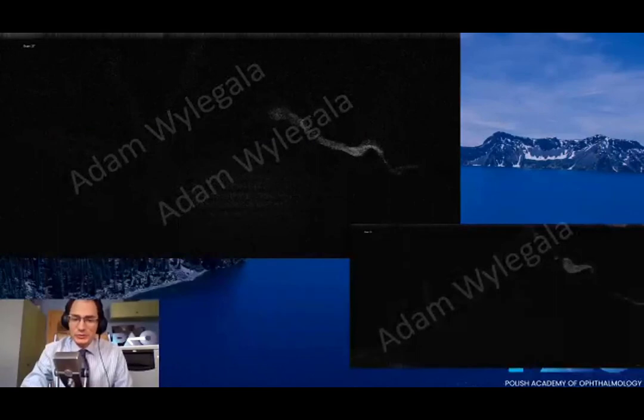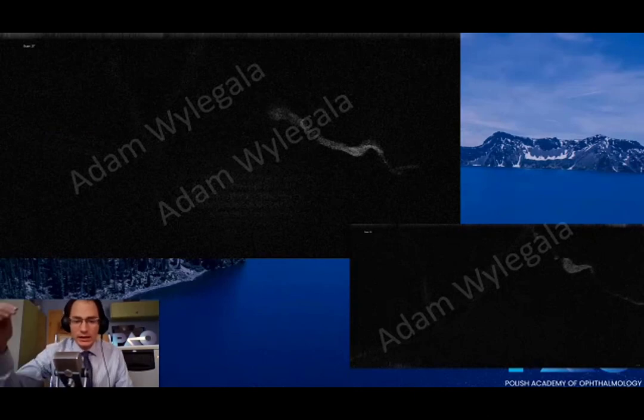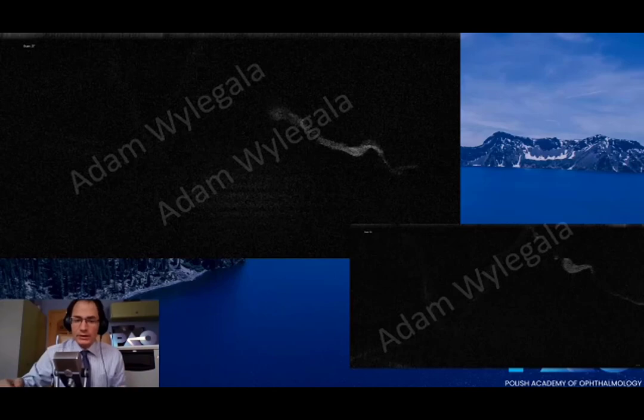Despite the hardships, we were still able to capture the floater, and it's pretty easy if you just change the focus or the Z gate, depending on your settings, on the type of device you use. You can do it. So you can see the floater.